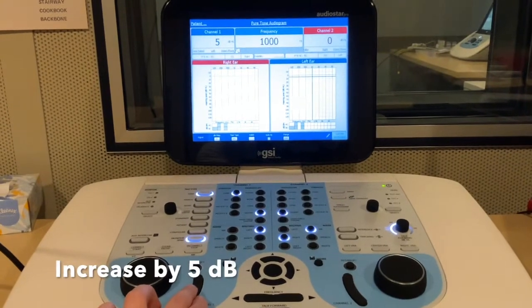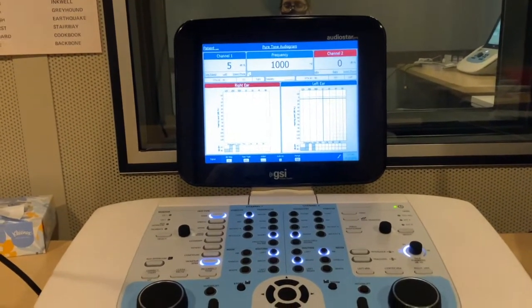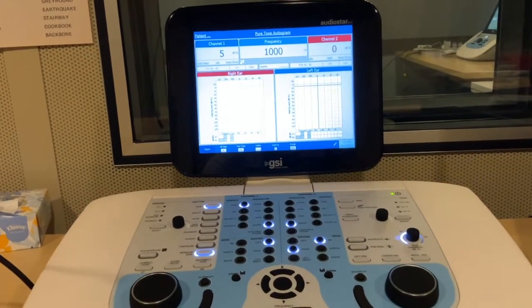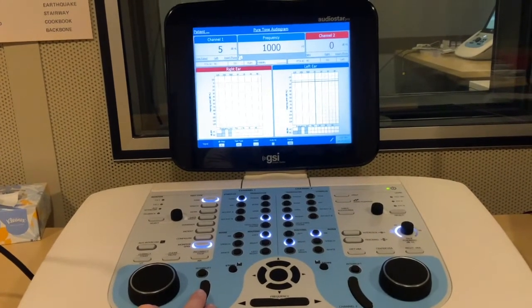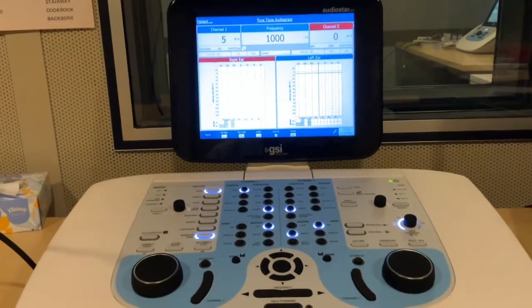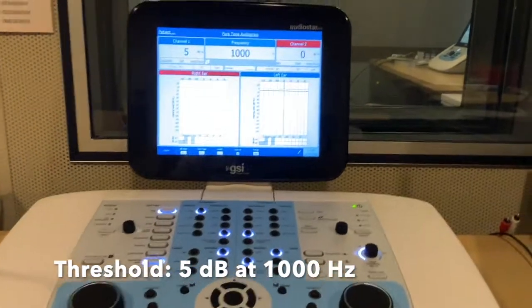If she responds at this one, again, we're looking for 50% of the time where she takes it. And as she didn't give us a response at zero those last couple times, that's not the threshold. So if she gives us a response at 5, we will take that as the threshold. Okay, looks like we have a threshold of 5 dB at 1,000 hertz in the left ear.